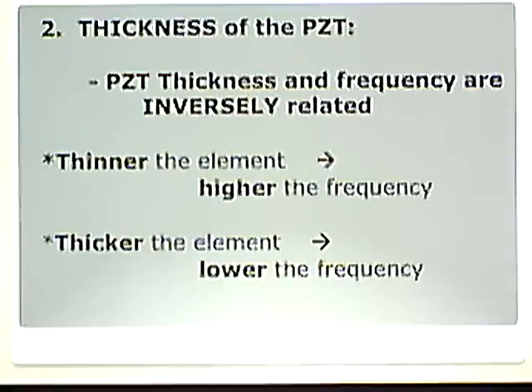Let's think about it. If I have a big, thick block of wood and I knock on it, you're going to hear that dull thud or that low thud. Versus if I have a real thin piece of wood and I knock on it, it's going to have that higher pitch or that higher frequency. It only makes sense. Think about it that way.